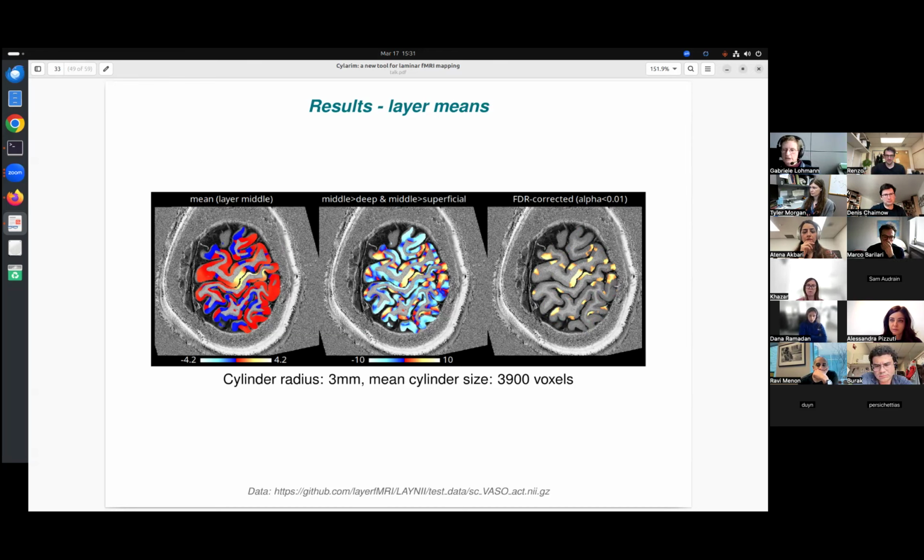Here I've used 3 mm again. And then, of course, one can do an FDR correction. Now we are actually doing 3 such tests, so it would be better to have a correction factor, not just an alpha of 0.05, but I'm a bit more conservative here. But still, you can see that almost everything here is statistically significant. Perhaps someone has an idea of why this might be.